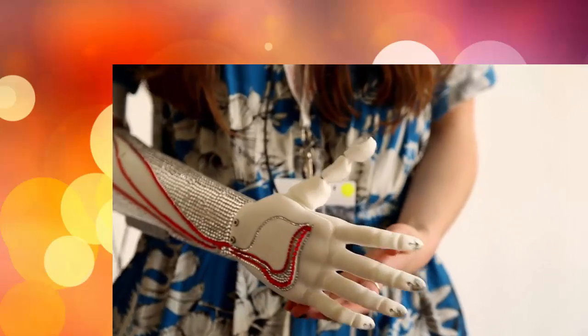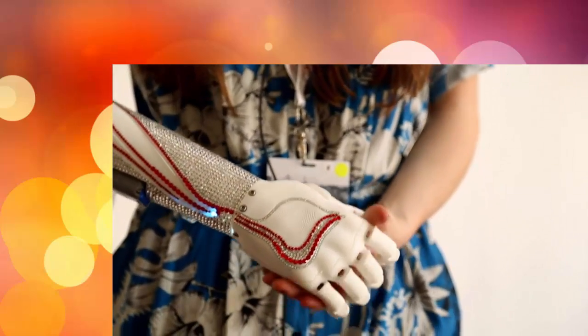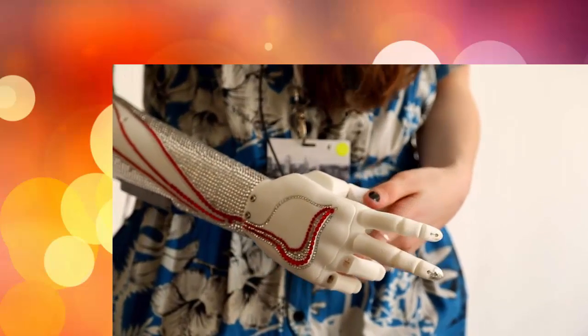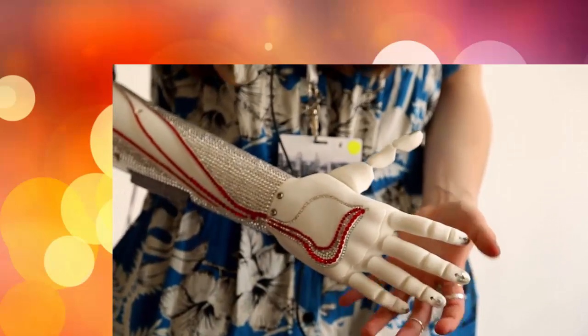This bionic hand is inspired by Grace. It's got loads of Swarovski crystals on it and fibre-optic wires, because we wanted to make a bionic hand that wasn't trying to pretend to be a human hand. We wanted to make something that was better, more fashionable, more daring.